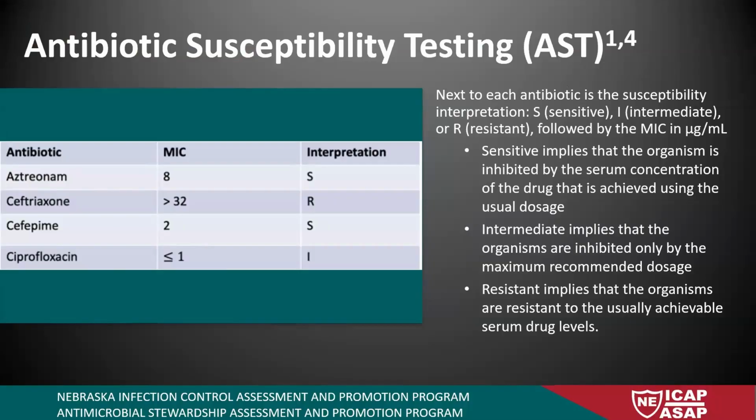And I thought this was a nice table to tell you, if you see this result, that usually there's an indication that they're resistant to certain antibiotics. So if you see a mecA gene or a mecA/C gene, those genes usually mean that in your test result the organism is resistant to methicillin or other beta-lactam antibiotics. And usually that has to do with a staph organism most commonly, but I'm sure that could be identified in other lab results.